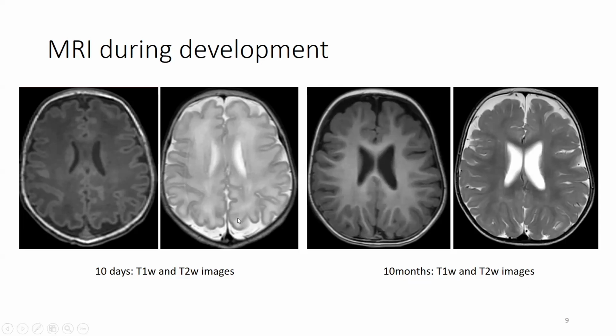Not completely, because there's not complete demyelination, but indeed in the MS lesions, so in the areas which have what we call acute demyelination, then you definitely see these lesions on the image. It's not exactly like this, but indeed, because the myelin is changed, we do see changes. And not only on the images, but also again on the ADC, because that's why I show these images.